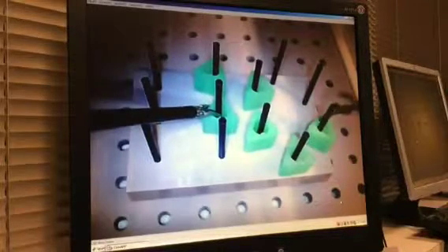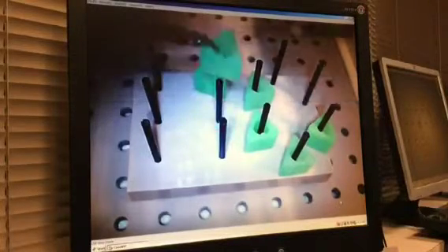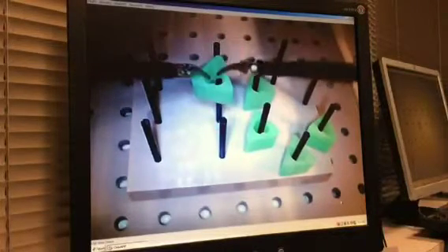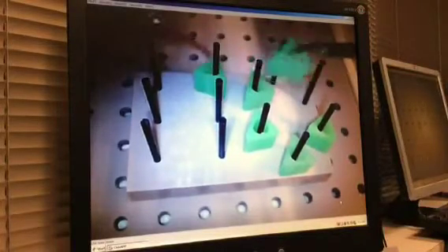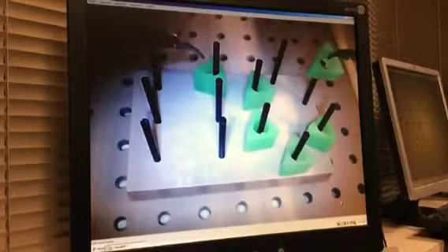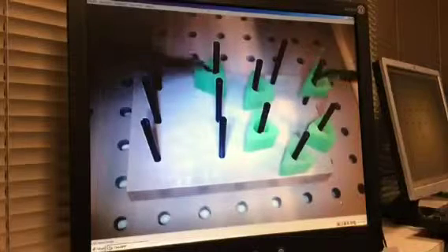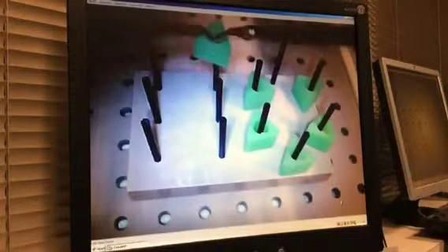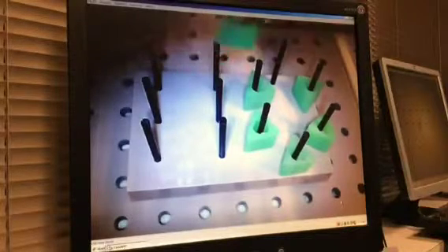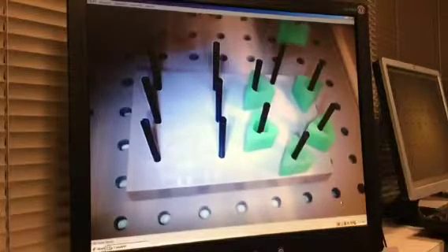My recommendation is to concentrate on smooth transfers between your two hands, and as you can see here as I'm putting down one peg I'm picking up the next peg.